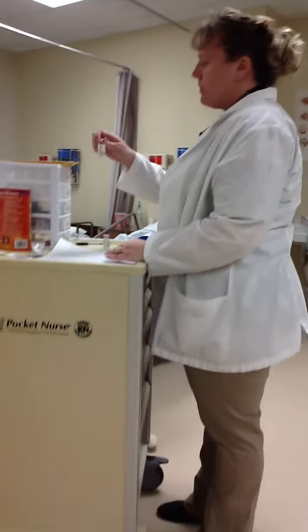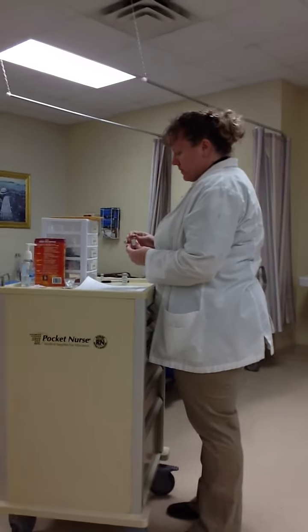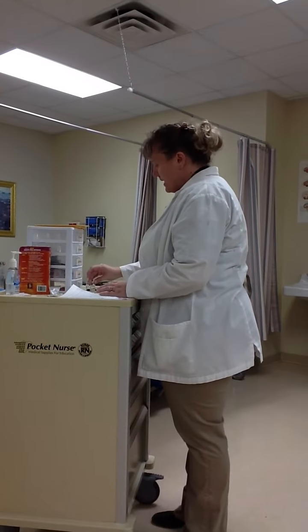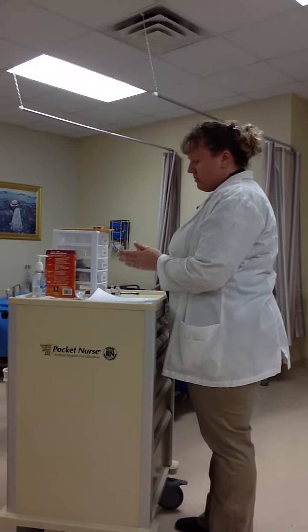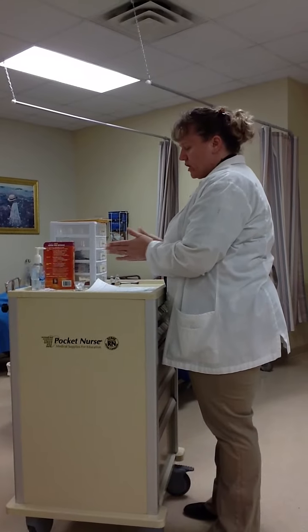As before, you want to make sure that you're checking those vials. If you use one that's a multi-use dose, make sure that it has the date and the initials that it was opened. With NPH, you want to make sure that it's mixed by either rotating it in your hands, moving it back and forth, but don't ever shake it.